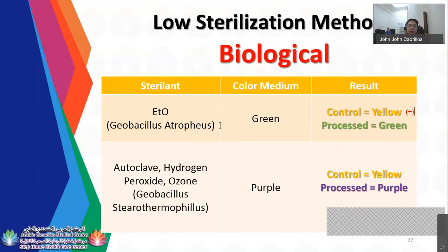it means negative, which means there is no bacterial growth, or there is a negative bacterial growth, which means that the result is passed. If your control doesn't change to yellow, it means you need to check.